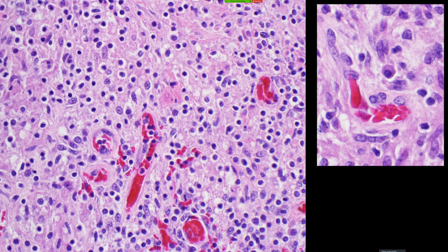And the granulomas didn't make sense. I think I did an S100 and it just showed patchy background dendritic cells and scattered Langerhans cells, like you see in any sort of process in the skin that's inflamed. So I thought, well, this is weird. I have to admit, I did kind of an embarrassing number of stains here trying to figure out what this was. And then I thought, plasma cells and granulomas, that always makes me think of something.